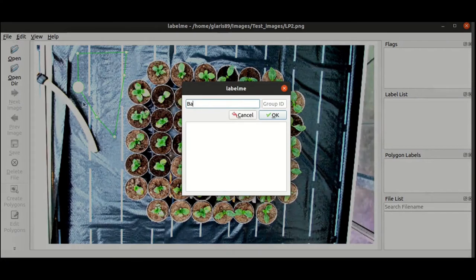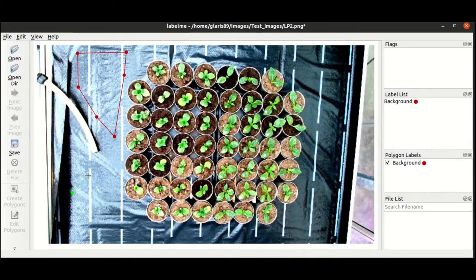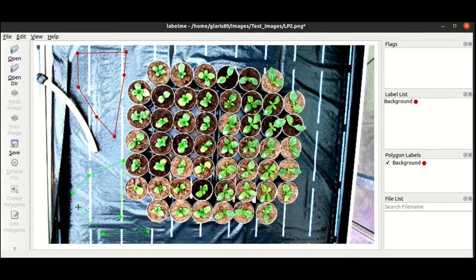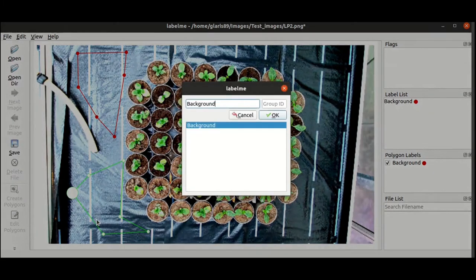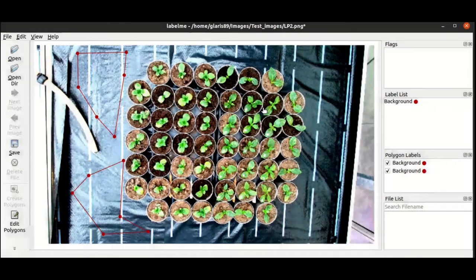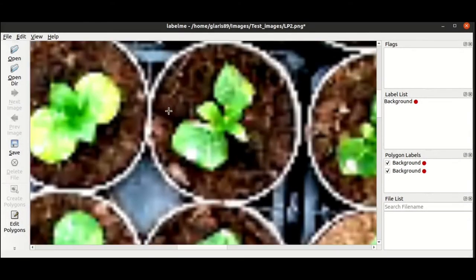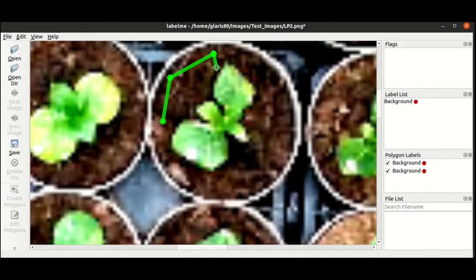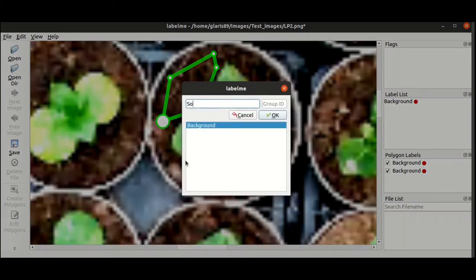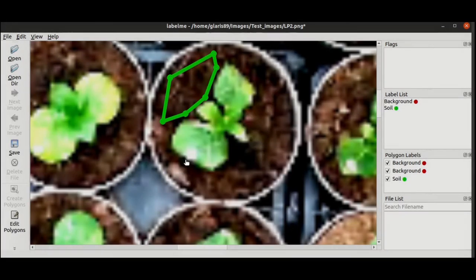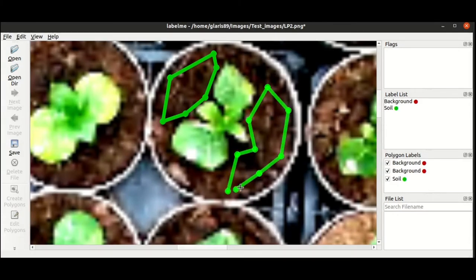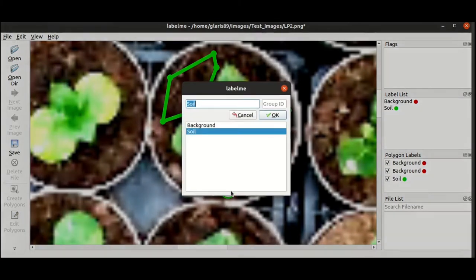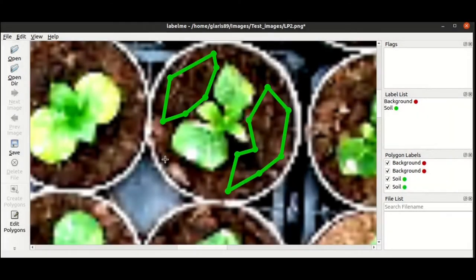You can also draw polygons. Here we have drawn a polygon corresponding to the background, and we can do it twice. So here it is also for the background. You use a tag you want to input. Here it is background, here it will be soil. It is the label of your annotation. So here it is soil for a second time.